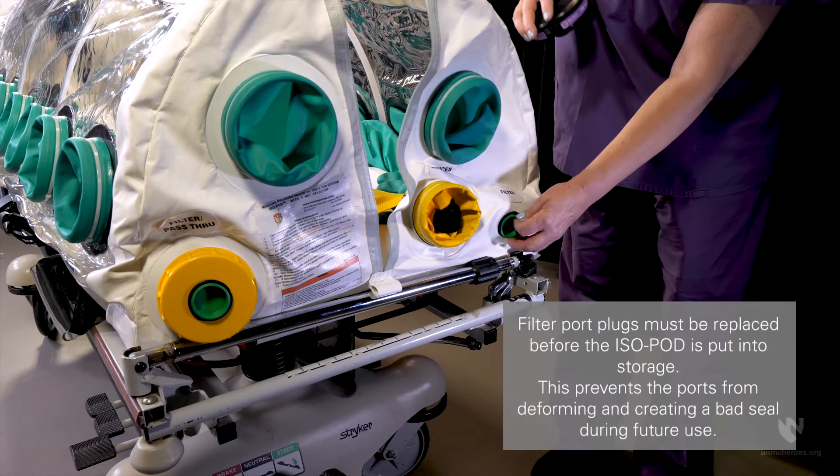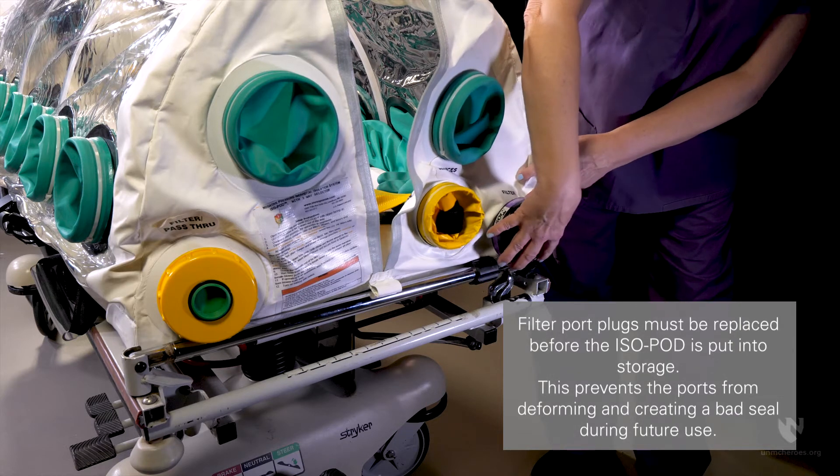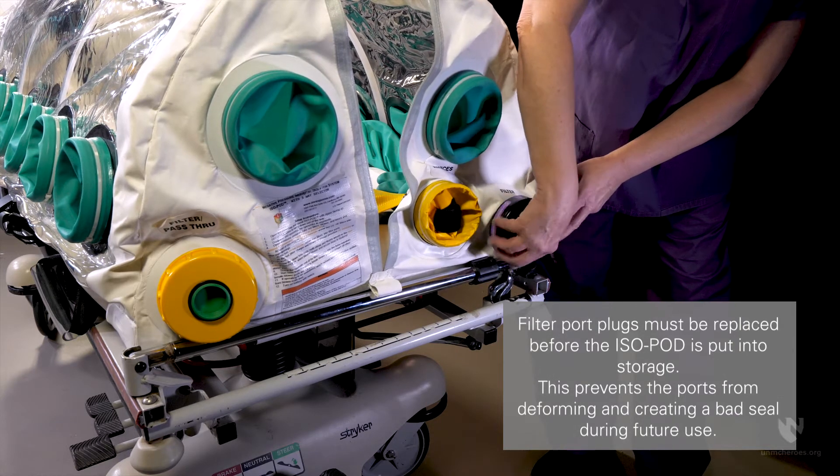Remove the two exterior filter port plugs on the head end of the enclosure. Then install a HEPA filter into each port.